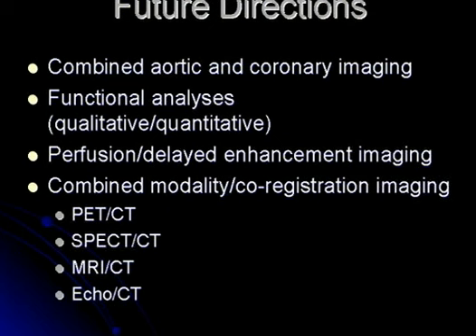So where are we headed with CT imaging? We've probably heard of the triple protocol, where we do combined aortic, coronary, as well as pulmonary artery imaging. We haven't been pursuing that in our institution just because our scanner is not in the ED, but that's something we're hearing more and more about. We're going to hear more and more about functional analysis, both regional and global, as well as perfusion by CT. And we're moving more and more into combined multimodality imaging for a cardiac assessment.